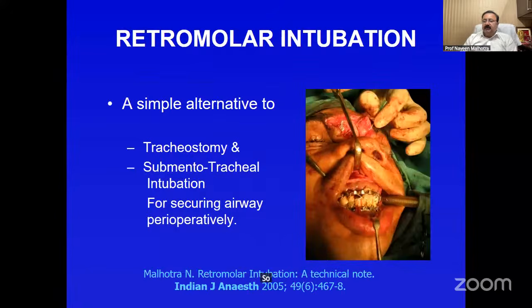So to avoid perioperative tracheostomy, retromolar intubation is a simple, non-invasive alternative to both tracheostomy and submentotracheal intubation for securing the airway perioperatively. And this was our original research article published way back 21 years ago in the Indian Journal of Anaesthesia.